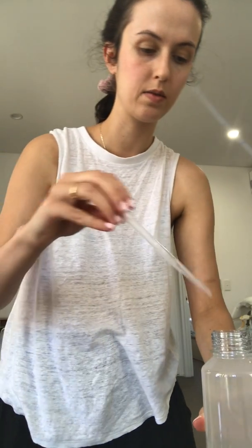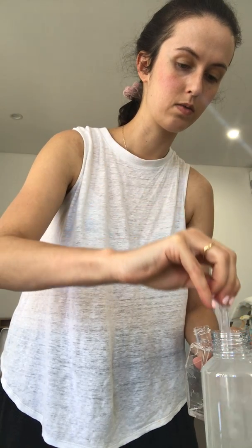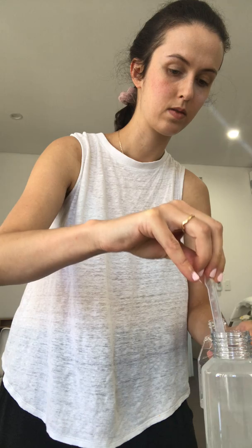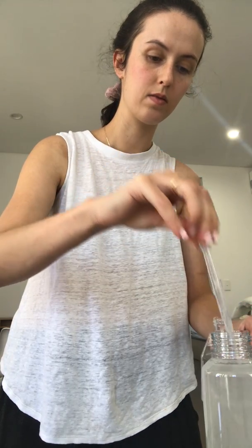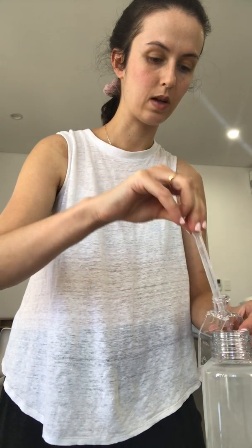Step two: we add into our culture flask. We're going to firstly add 50 mils of the culture media into the flask. This is where the pipette comes in, because we need to transfer it in the safest way possible without spilling any. You can use any amount of culture media, but 50 mils is what is recommended in the instructions, so that's what I'm going to start off with.